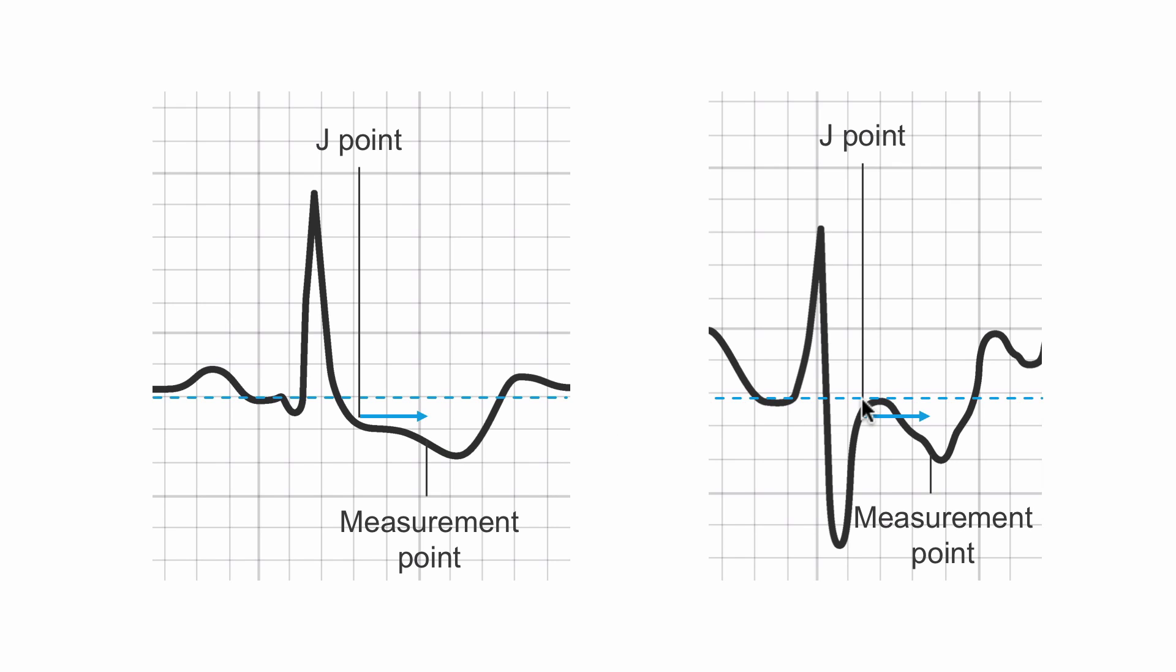Here's our J point. Sometimes it's hard to see exactly where that is, but this seems to be it. We go two boxes over, two small boxes. We're in the middle of a box, so this would be one box, two boxes. Here's our measurement point. Two little boxes, which is 80 milliseconds at standard calibration, 0.08 seconds after the J point. That's our measurement point for the ST depression.